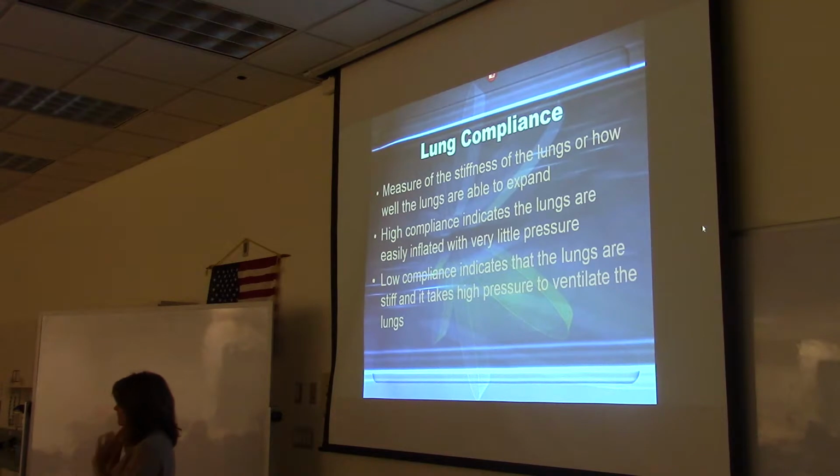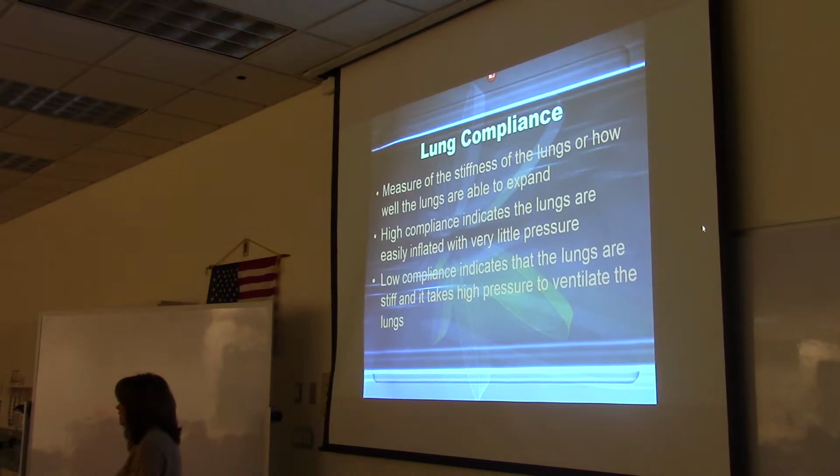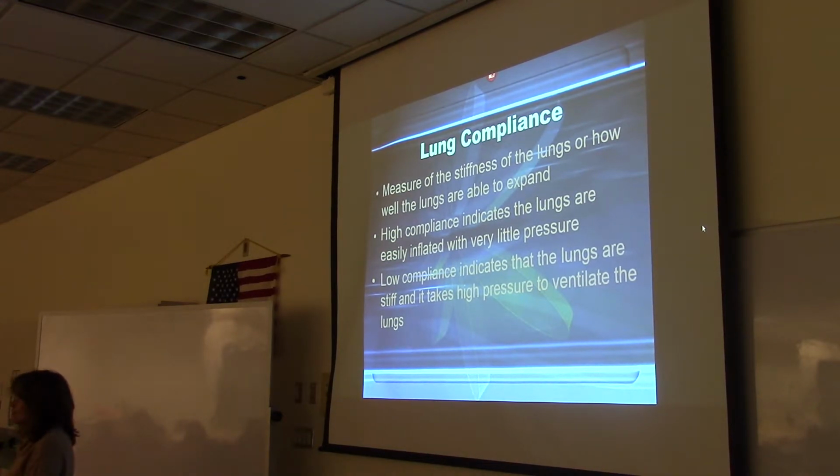So you send a volume of air into COPD lungs and you're going to notice not much pressure builds up, because those lungs are very compliant. They're very stretchy. It's very easy to get the air in. So that's what high compliance is. Do you want to write that example down in your notes so you can attach it to a picture in your mind? Isn't it good to have high compliance, or it's not good?